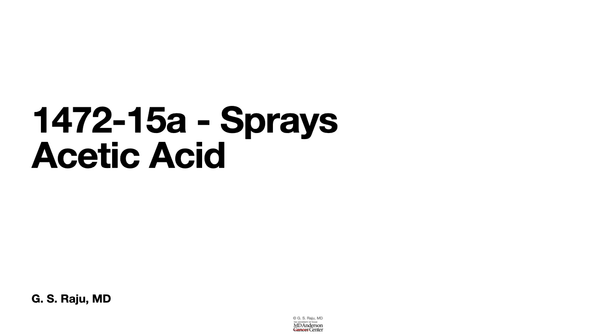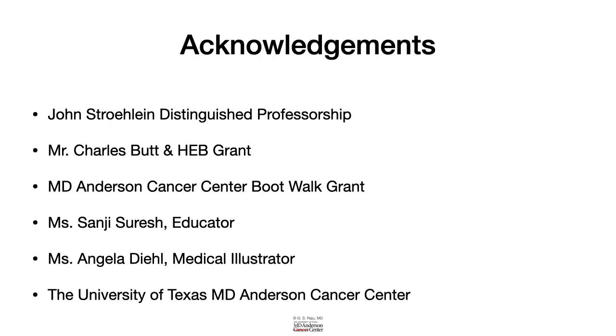Greetings. Let us learn about the role of acetic acid spray in gastrointestinal endoscopy.